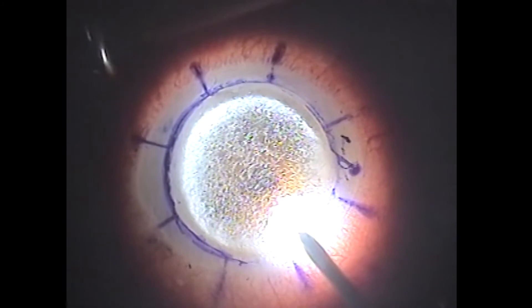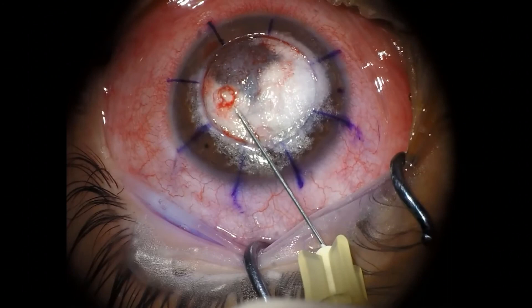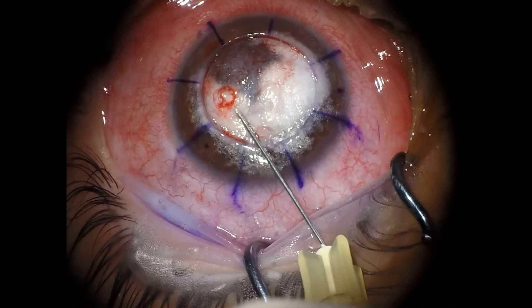This last case involves an 8-year-old patient with a fibrotic post-abscess cornea. After injecting the air, it's hard to tell if the bubble is in place. The transillumination clearly shows us a type 2 bubble. Even though the bubble is of medium size, we didn't inject more air because of the risk of rupture. Instead, we decided to clearly mark the borders and center of the bubble.